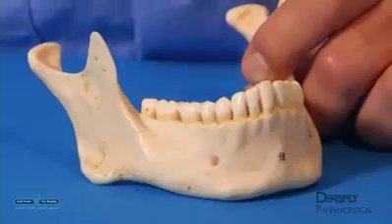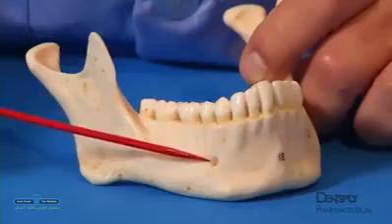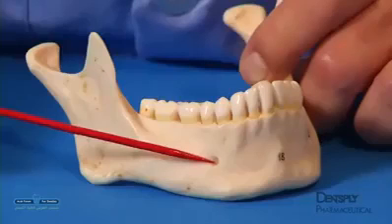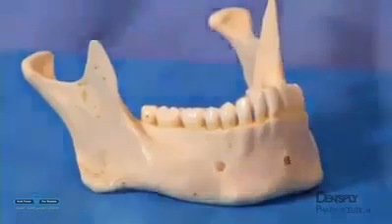The target for the injection is at the mental foramen, situated just below the apex of the mandibular second premolar. Its location can be determined with the aid of radiographs and by gentle palpation in the buccal vestibule. For a successful mental nerve block, there is no need to penetrate the mental foramen with the needle.